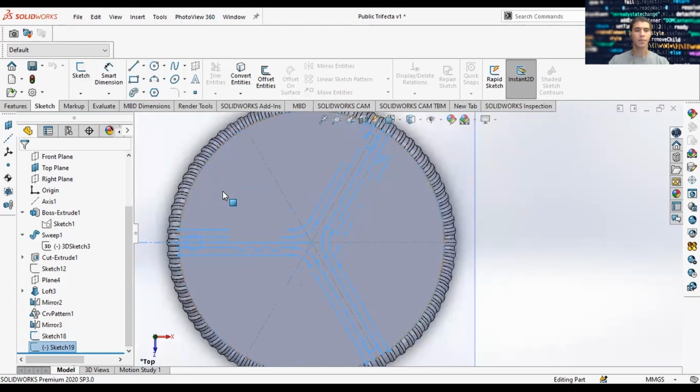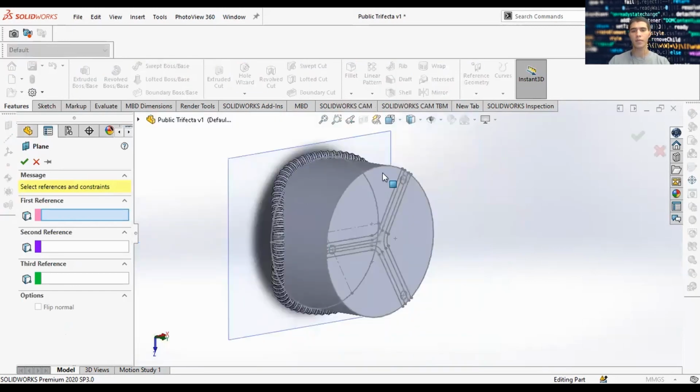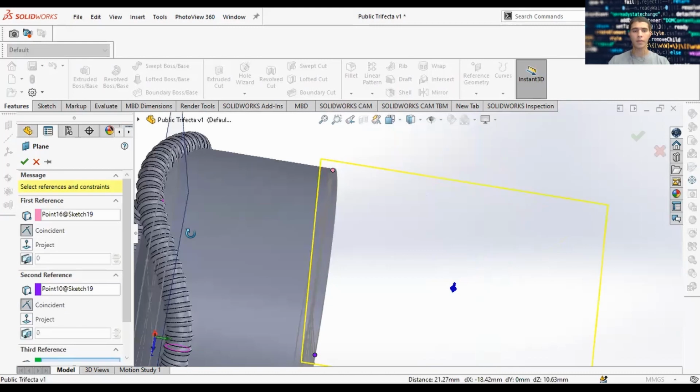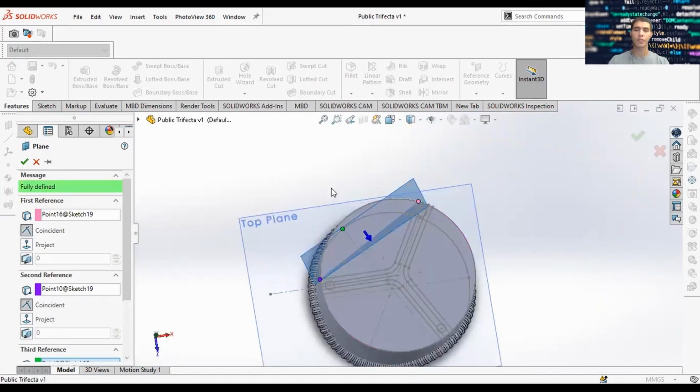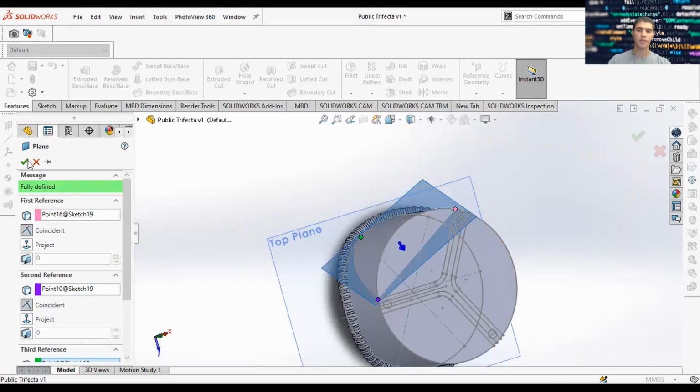Let's go ahead and incorporate that spline feature. So we're going to make a plane first of all. Reference geometry, and then go to plane. And we're going to select this edge, and then this edge. So the two sketches we had, one for the top face and one from the bottom face, those are going to make a plane at 3 points.